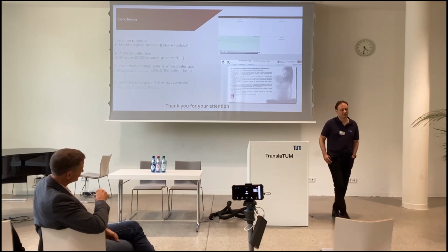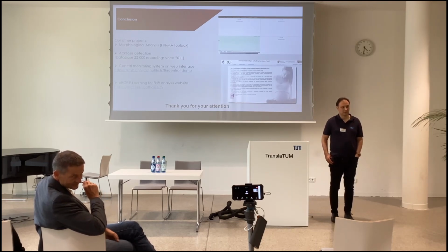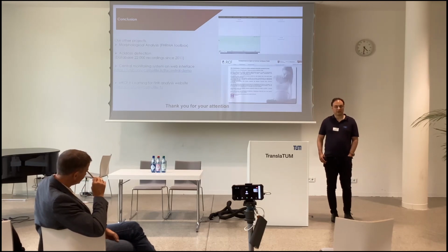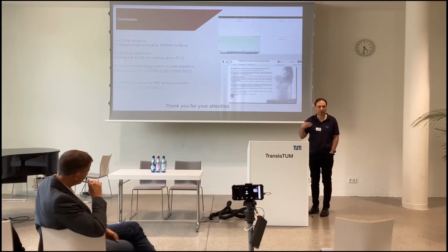So the fetal heart rate that you showed, were the signals acquired via the fetal scalp electrode, or via an abdominal transducer? External or internal? Yes, we have done two models. In fact, I present only the external one here because it is most interesting. But we have also made a model for the internal sensor to recognize false signals in the internal sensor. But there are very few false signals in internal, so this is a less interesting project.